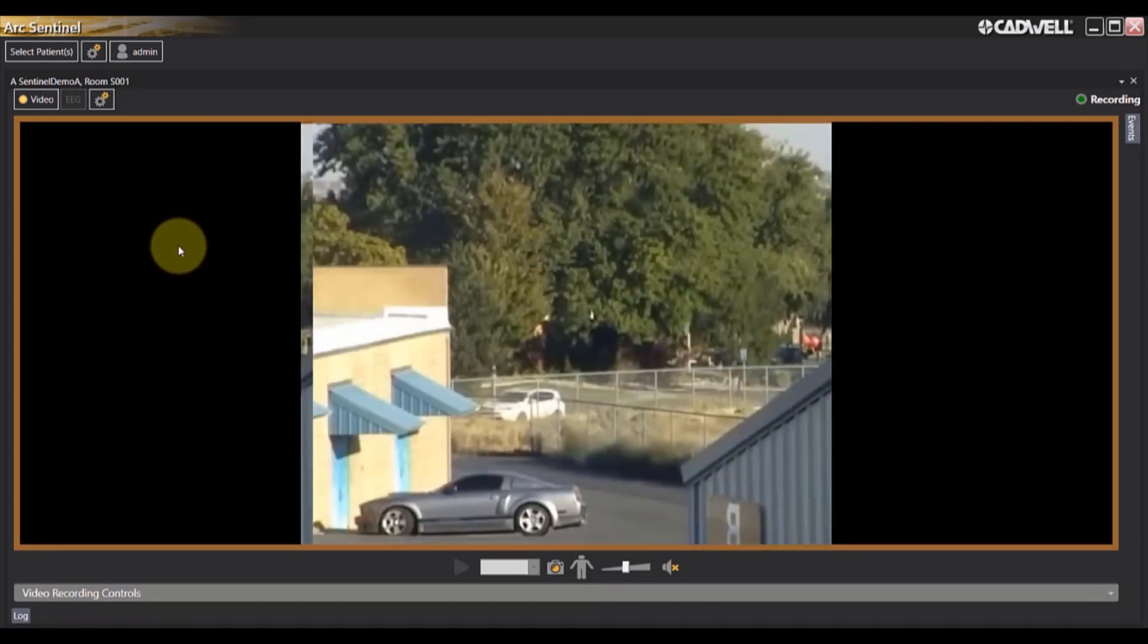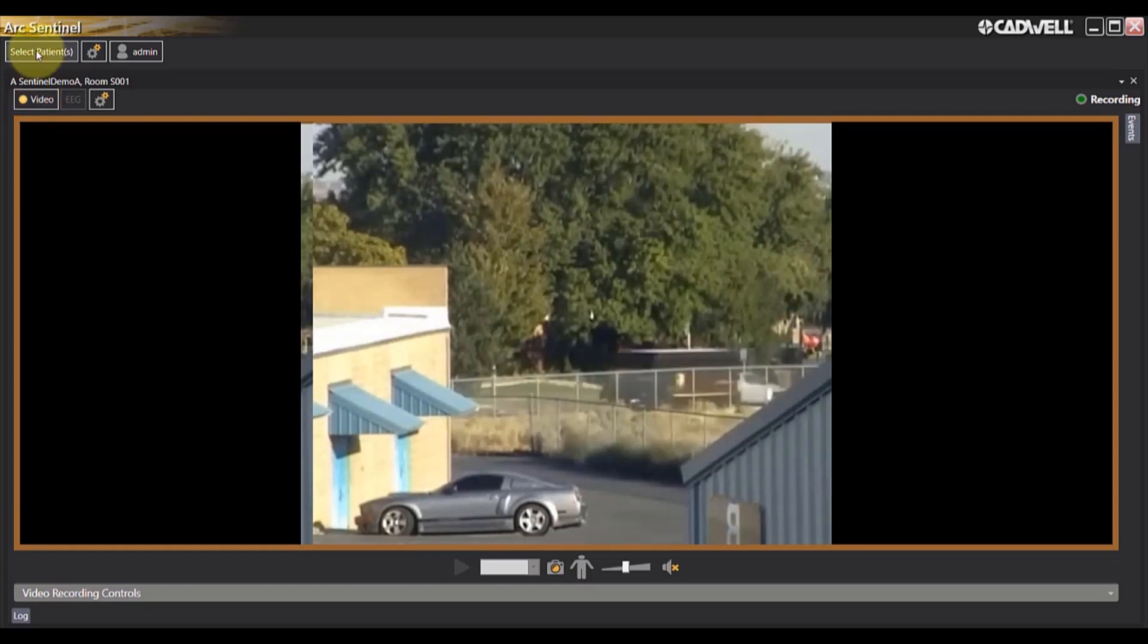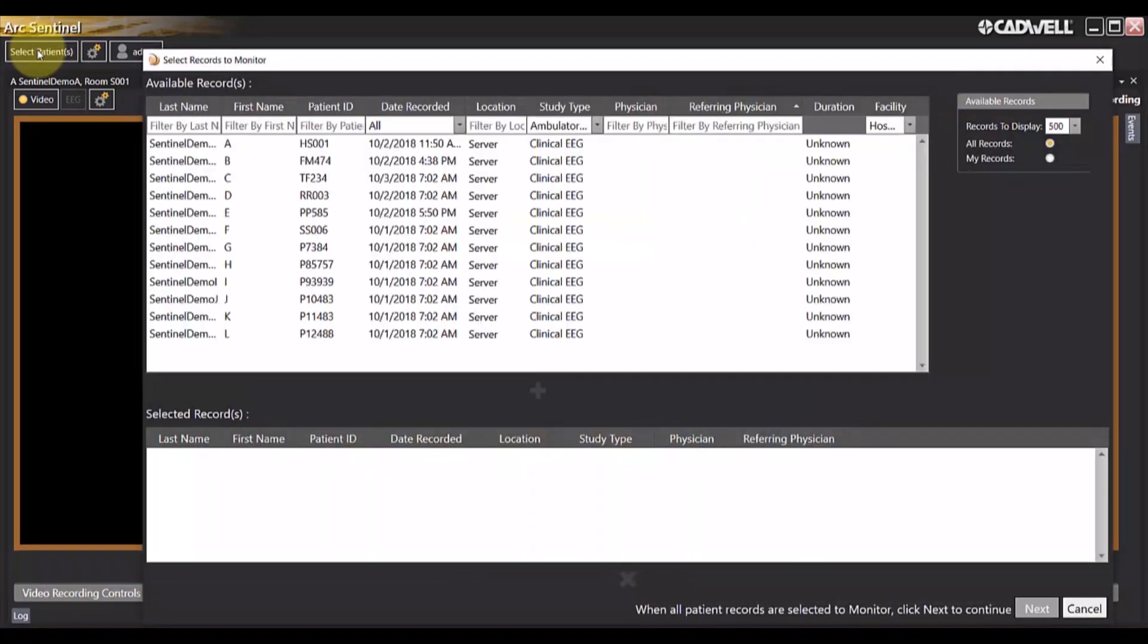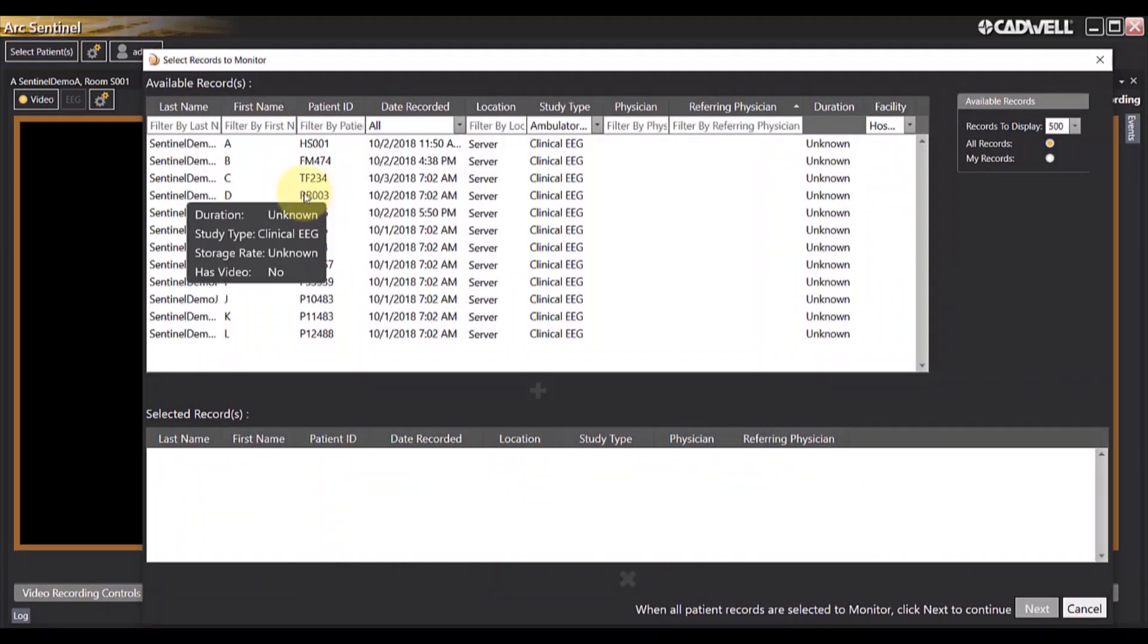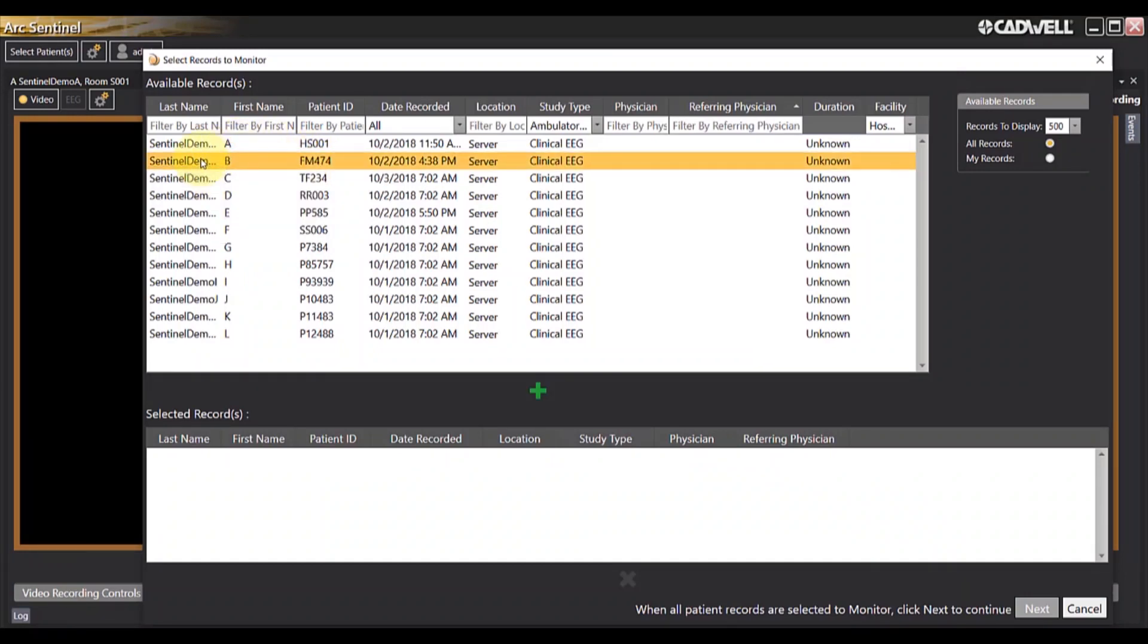To add additional patient monitored rooms, simply navigate to the Select Patients icon at the top left of the screen and left click. This will bring you back to the Select Records Monitor screen, where you can choose additional patients to monitor.